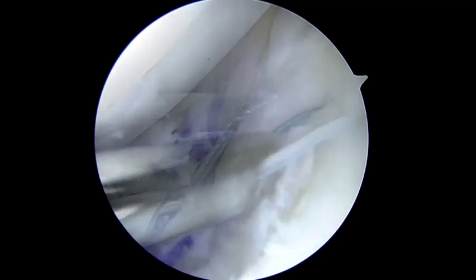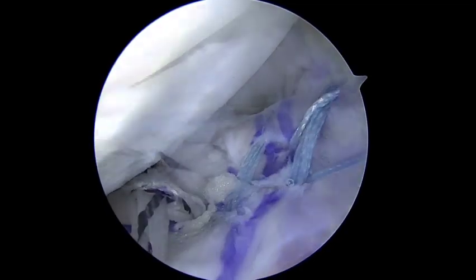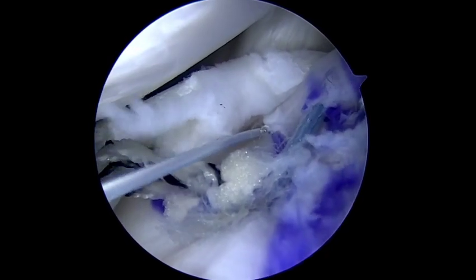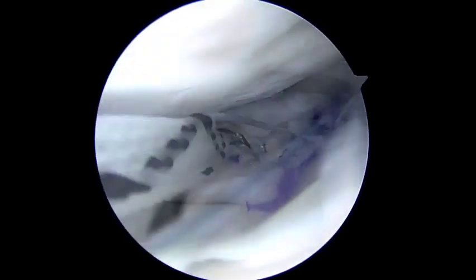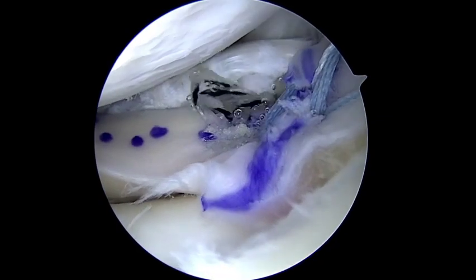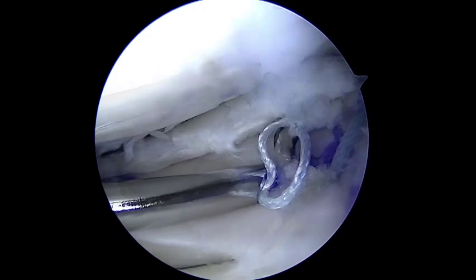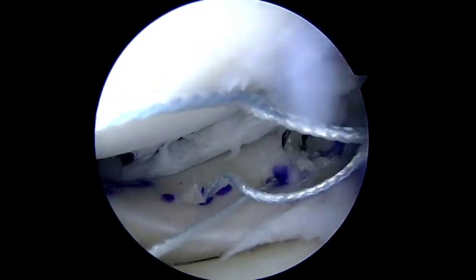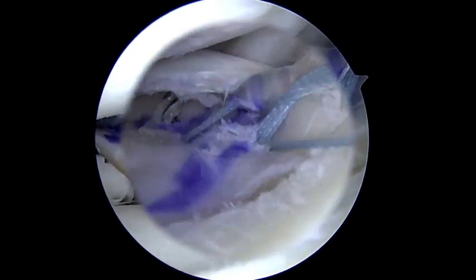An inside-out meniscal repair is then performed using a zone navigator to secure the meniscal allograft to the remaining native meniscal tissue and capsule. Finally, the suture that was previously shuttled through the root repair tunnel is fixed with a single swivel lock anchor, ensuring appropriate tension on the meniscal allograft.